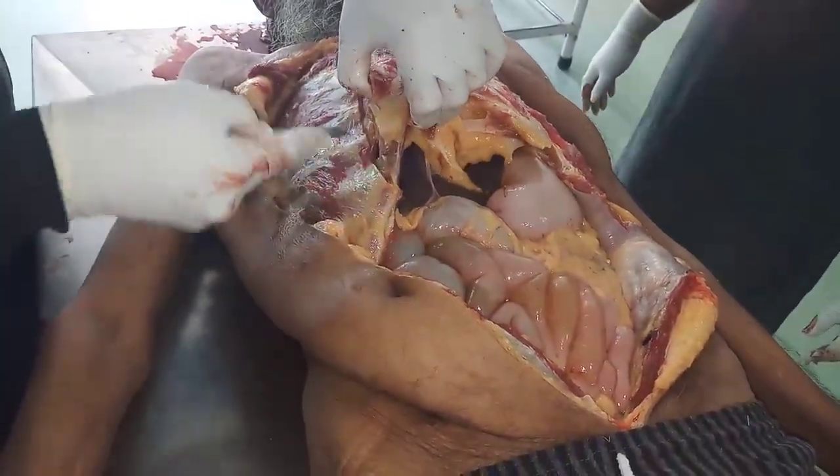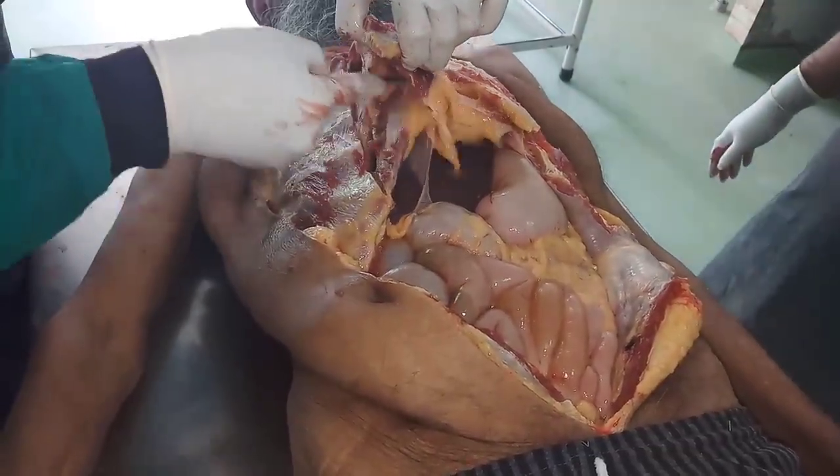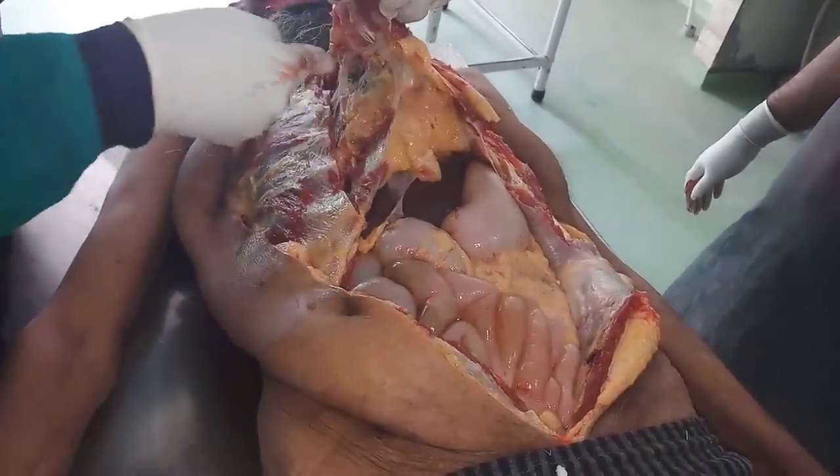Now we'll remove these sternopericardial structures, the attachment between the sternum and the pericardium.